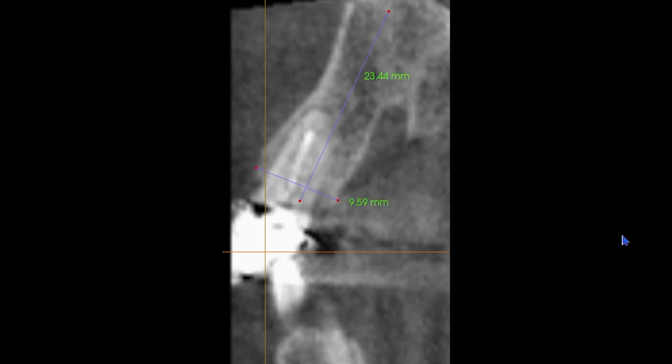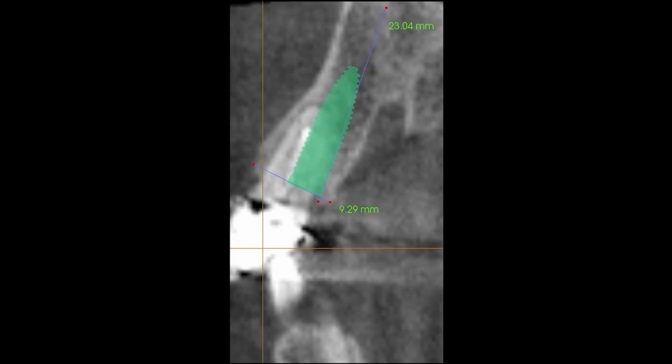So here is your pre-op radiograph. As you can see, the patient's got a little bit of an abscess here. The other thing the patient has is a ton of bone. Thank you, Jesus. We like that. So what I'm doing here is I'm planning out the case virtually. I think that the more you plan these cases out, the more you think them through before the surgery, the better the surgery will go. So what I want to do is I want to come out here toward the lingual, as I told you. So I'm setting up my implant to come out this way, and I also want it to bite into some decent bone down here. This is one of the times when I'll use a longer implant, is with immediates.